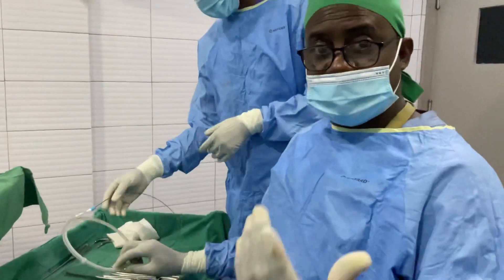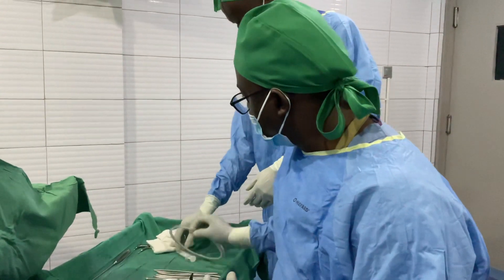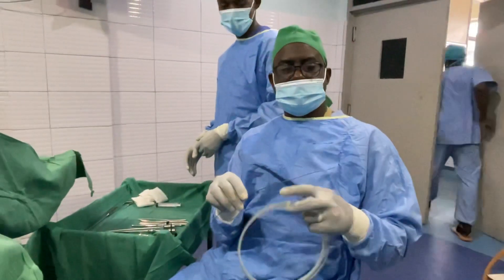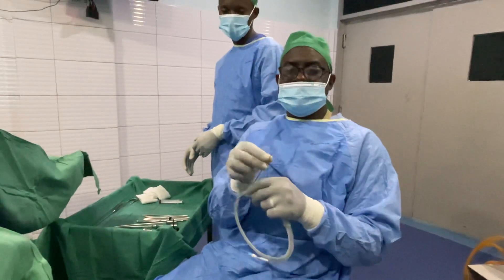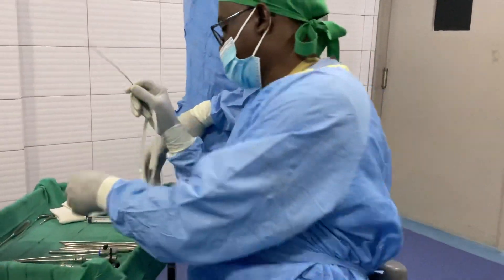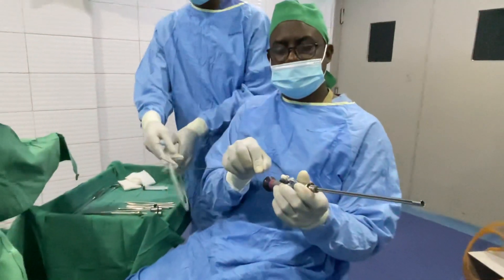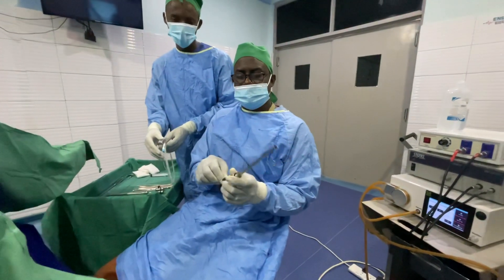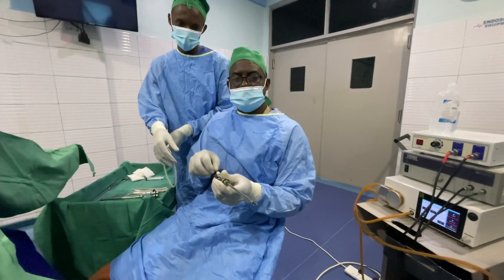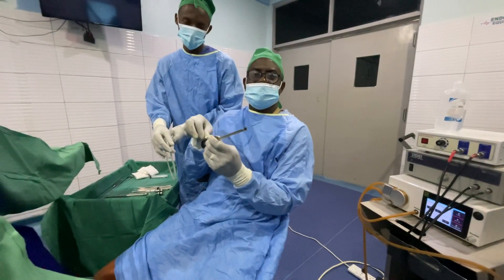On this patient we are going to do tubocannulation to see if the tubes are functional. This is what you call a hysteroscopic tubo-catheter. It is about 5 French and it is slightly curved at the tip with a guide wire that goes through. We introduce this through the working channel of the external sheath and we are able to cannulate the tubes individually.